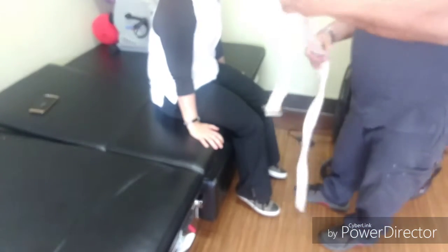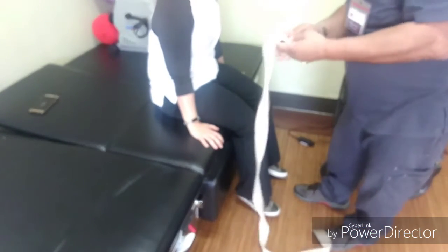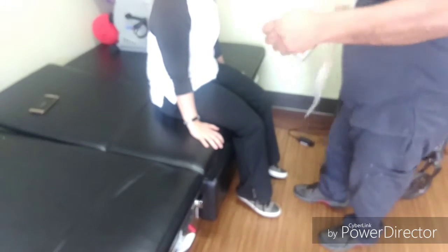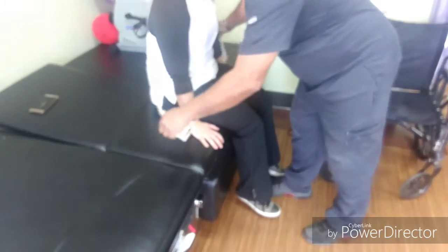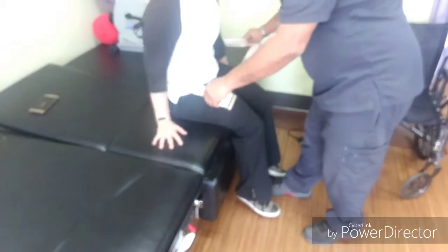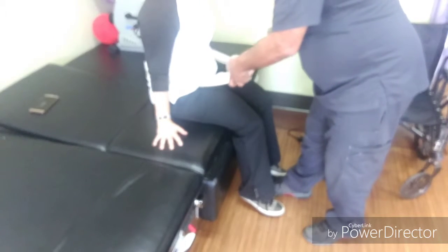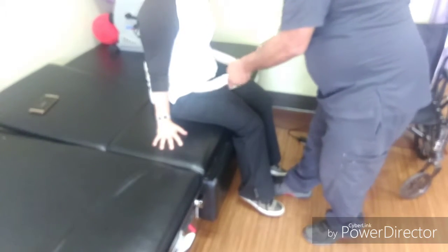And I'm going to use this gait belt as a safety precaution to get you to this chair. So here we go. We're going to place the gait belt up. If you raise your arms for a moment. There we go. Thank you so much. And we'll latch through. There we go.